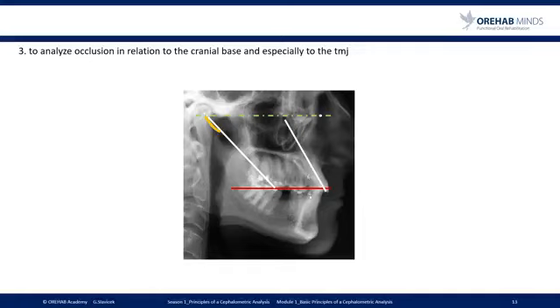In addition, we can add the information of the anterior guiding structures, the lingual morphology, to the Ceph, and then we have this dynamic situation to be analyzed, to be understood, and to be used in the therapeutic strategy in oral rehabilitation.